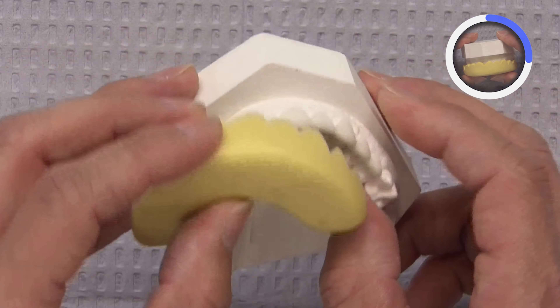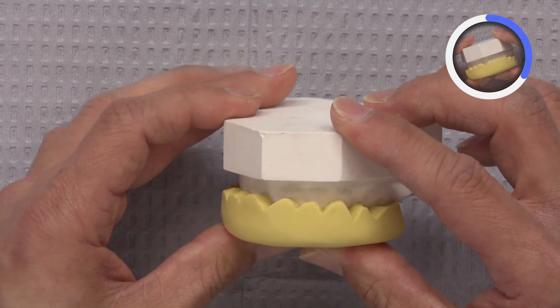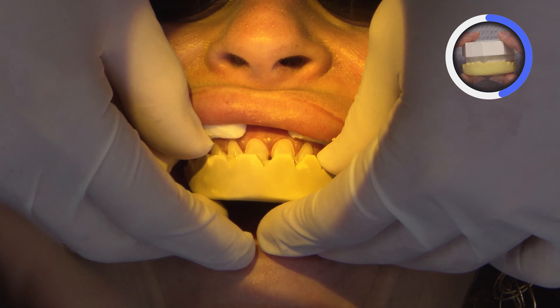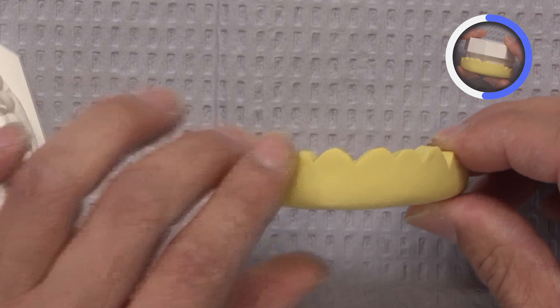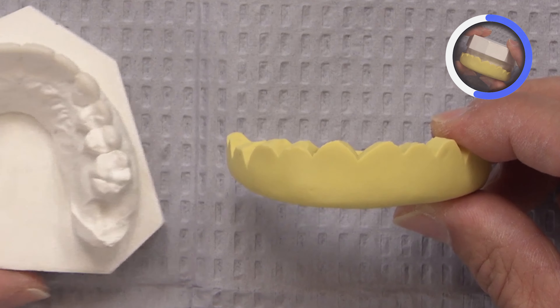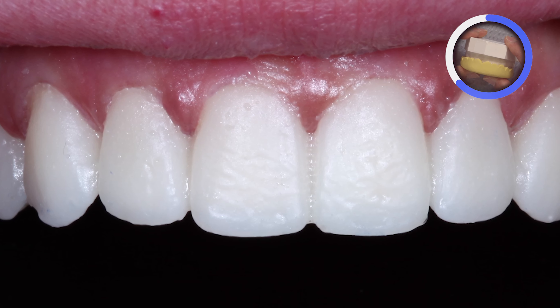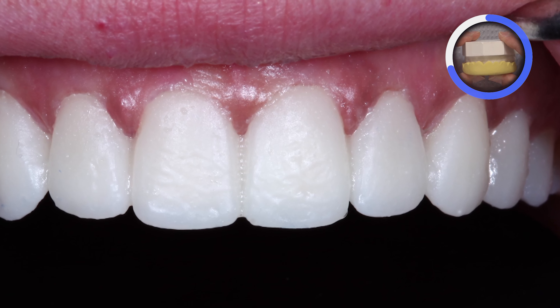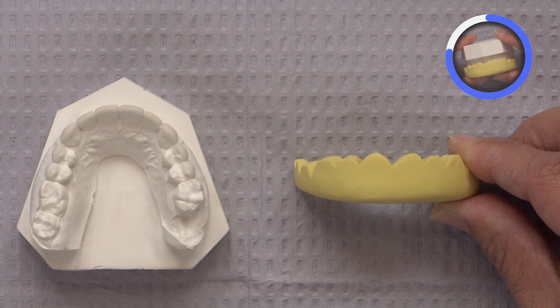The putty matrix is created once that ideal diagnostic wax-up has been made. We will then apply some bisacro material into the matrix and seat it on the patient to have the patient trial-fit this — they can wear it for a day. I actually recommend having them wear it for a week, so they can see if they're comfortable with the planned incisal edge positions, the added bulk if there is any, and to see if their speech patterns are the same.